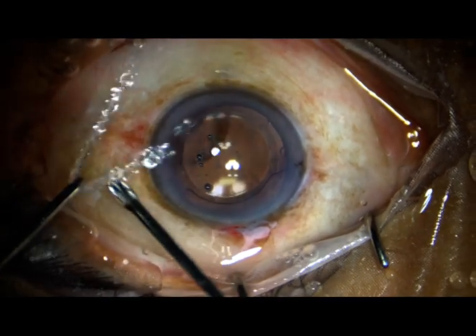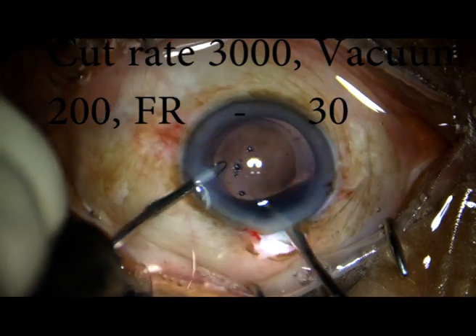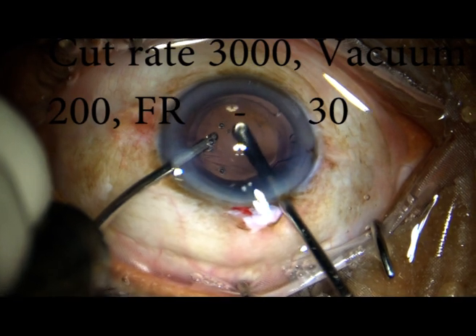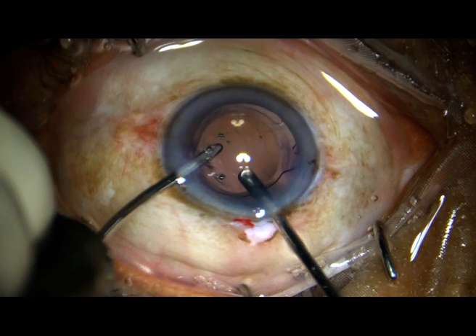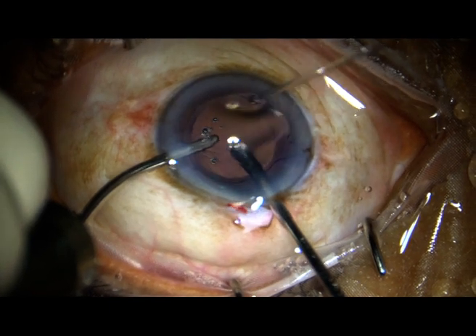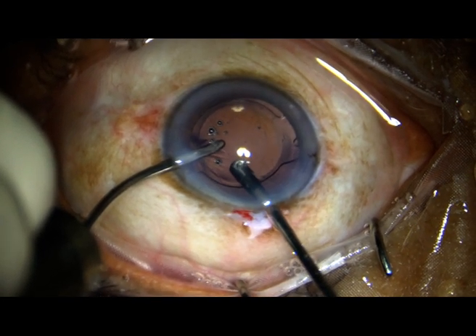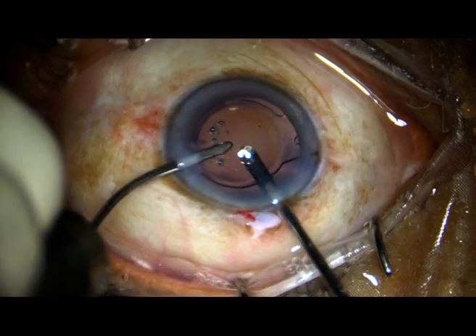I take the vitrectomy cutter — this is a 23G cutter — and performed anterior vitrectomy. A lot of visco is there which is mixed with the anterior vitreous. Unless I remove that, the media will remain very hazy for a long time. So I performed a thorough anterior vitrectomy, and in that process all the visco that was there got removed.